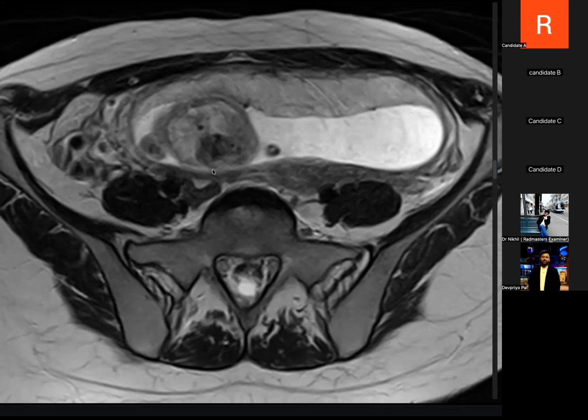So before I did an MRI for this patient, assuming for a fact this patient would have gone through ultrasound, right? And let's say on ultrasound, like you said, there were no signs of torsion. Would you be completely excluding a possibility of torsion if the ultrasound was normal? No, because clinical is important, because sometimes torsion cannot be completely ruled out even with preserved vascularity. Can you give me another reason why the flow can still be preserved even if there is a torsion? Why?